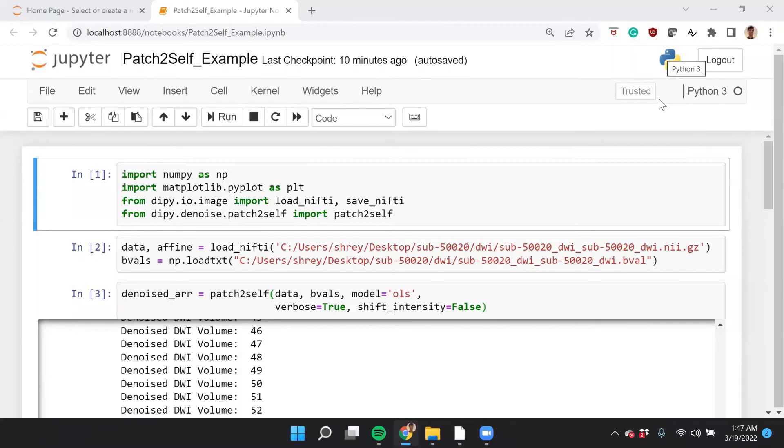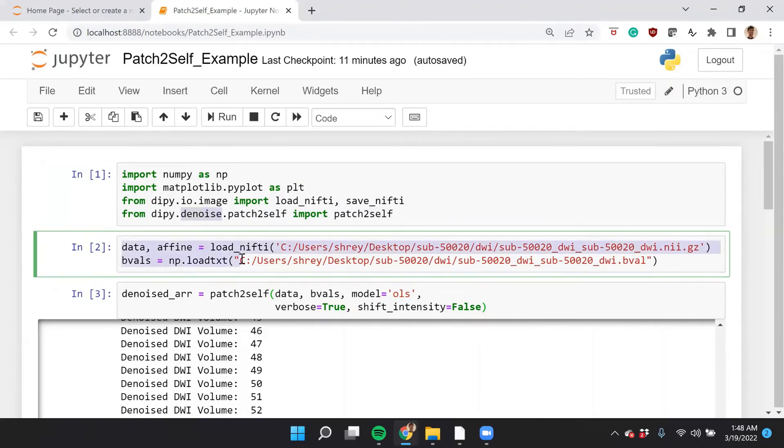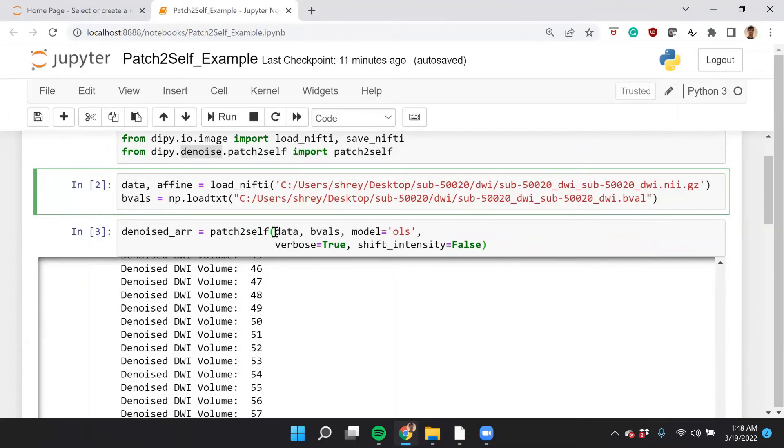Anyway, so enough of explaining the method. Now let's look at the implementation. There are two ways of implementing Patch2Self. You can either use Patch2Self via the Pythonic API, that is via DIPY. And the other way is to use the command line interfaces that we provide within DIPY. Let's first look at the Pythonic API. These are some basic packages that you need for plotting, for executing numerical operations, loading and saving nifty files. Patch2Self is loaded via this module, which is in the denoise module of DIPY. So here, I first load the nifty file and the b-values.